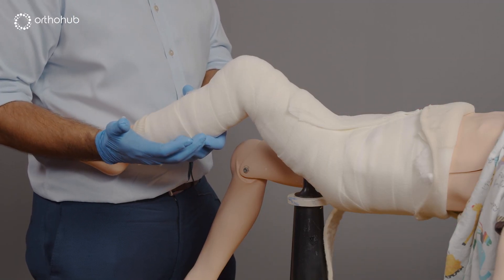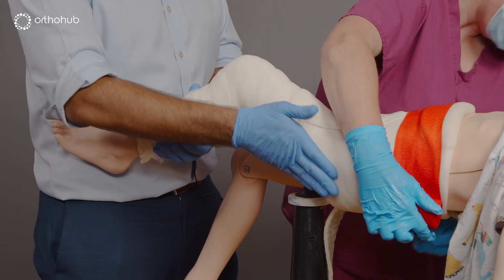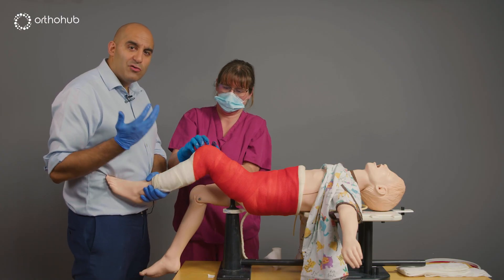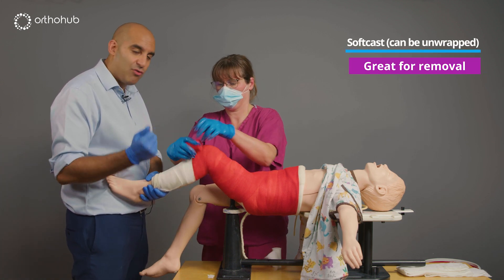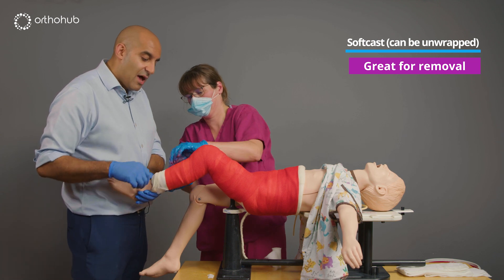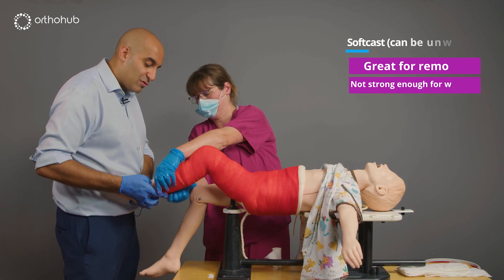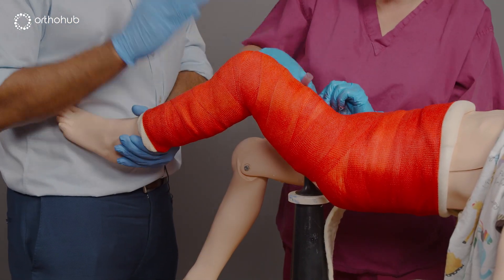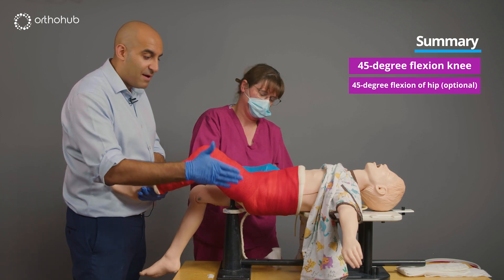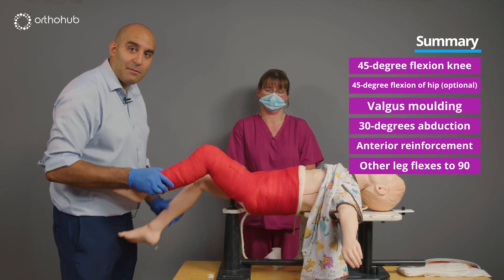We apply our final layer of scotch cast — the brighter the better. We give children an option of colours, and my colleague is notorious for having sparkles at this point. There is also soft cast material available which unwraps — we've trialled it as it avoids needing a plaster saw for removal at six weeks, but if wedging is needed, it's too soft to provide adequate stability for that. The completed one-legged spiker cast has: 45 degrees of knee flexion, 45 degrees of hip flexion, valgus moulding at the fracture site, 30 degrees of abduction, reinforcement at the front, and the contralateral limb completely free to move.